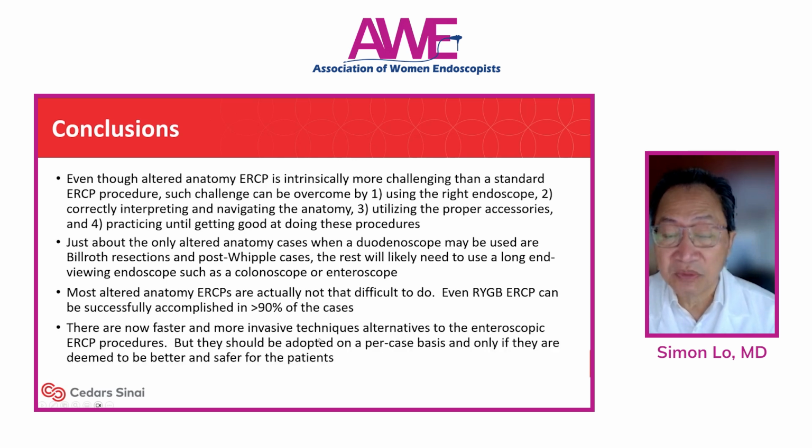There are now faster and more invasive techniques as alternatives to the enteroscopic ERCP procedures, such as the EDGE procedure. But these procedures should be adopted on a case-by-case basis, and only if it is deemed to be better and safer for the patient.